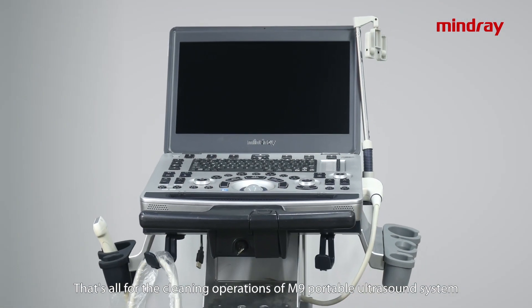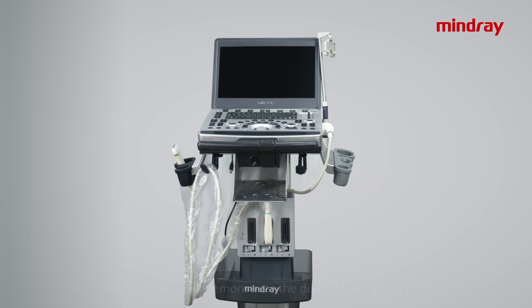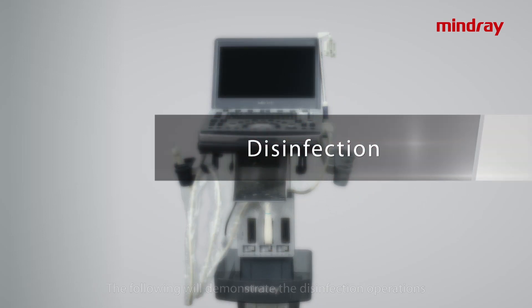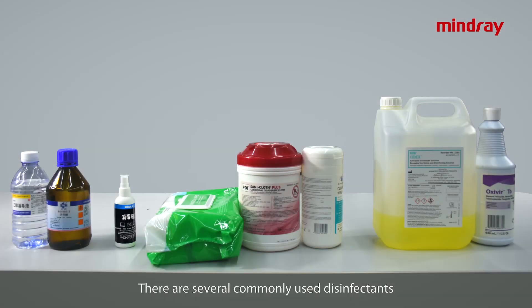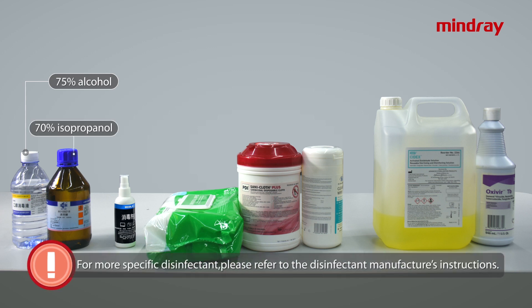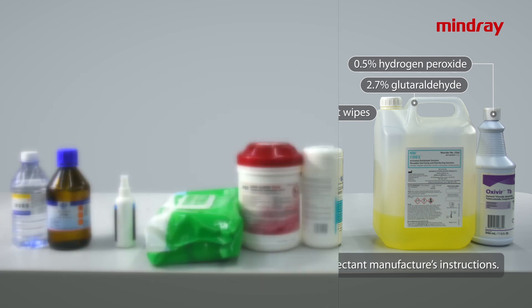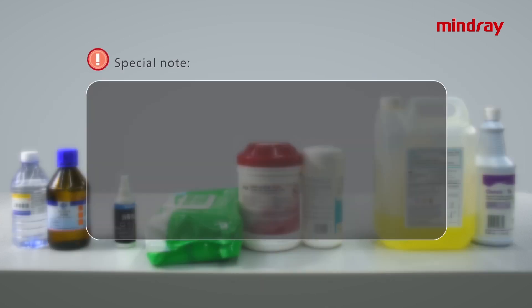That's all for the cleaning operations of the M9 portable ultrasound system. The following will demonstrate the disinfection operations. There are several commonly used disinfectants: 75% alcohol, 70% isopropanol, special LCD screen disinfectants, quaternary ammonium salt wipes, 2.7% glutaraldehyde, and 0.5% hydrogen peroxide.